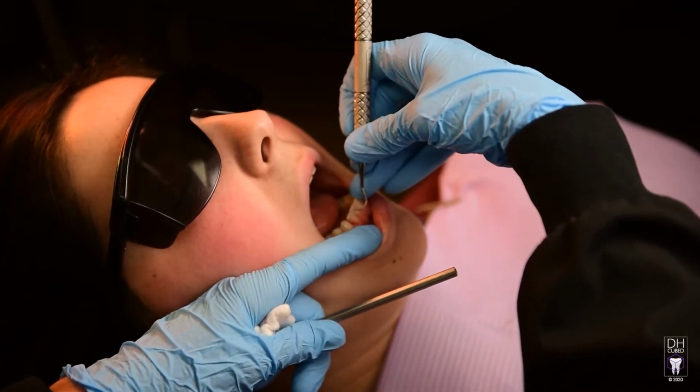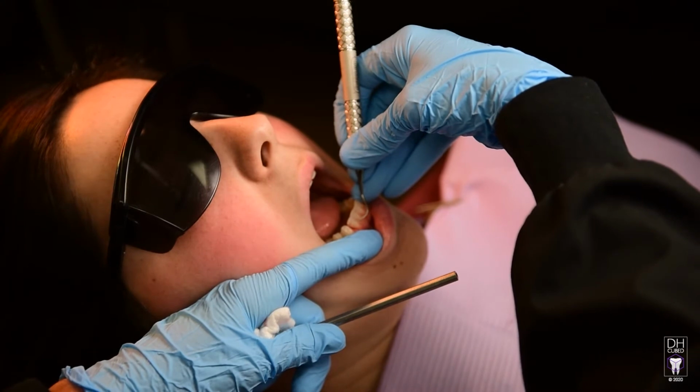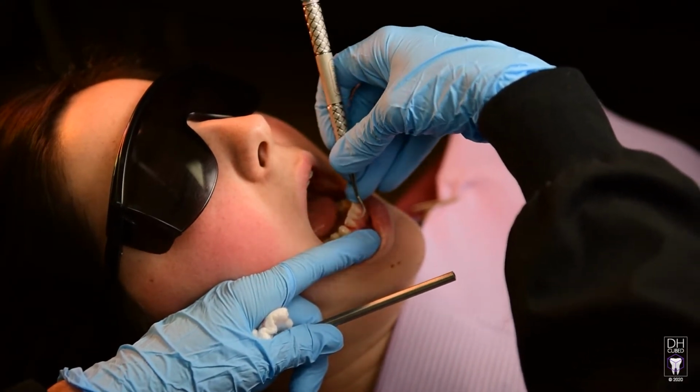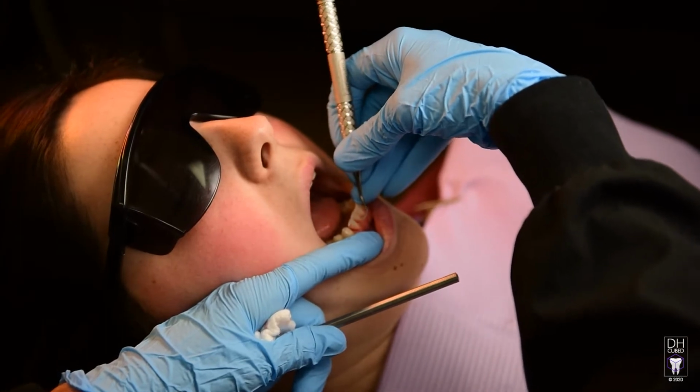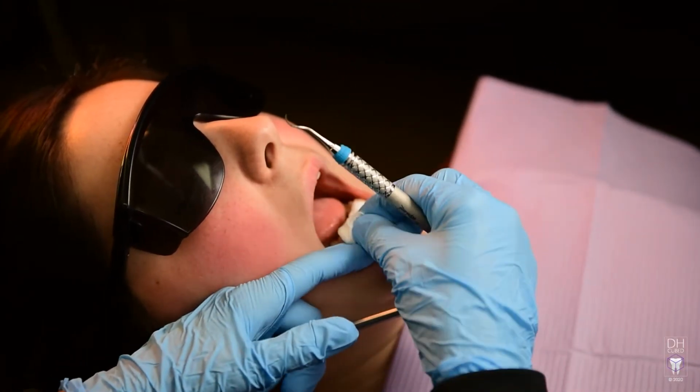And the operator will not slip, potentially cutting the patient or themselves. All of this builds the patient's confidence in the hygienist due to the light touch, ease of the appointment, and sense that a good job is getting done.